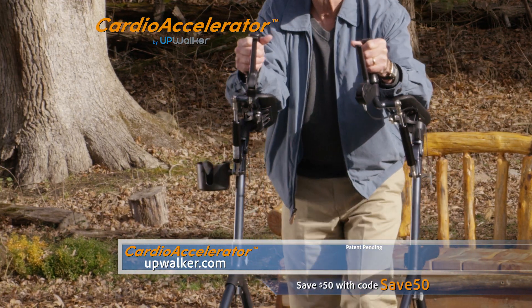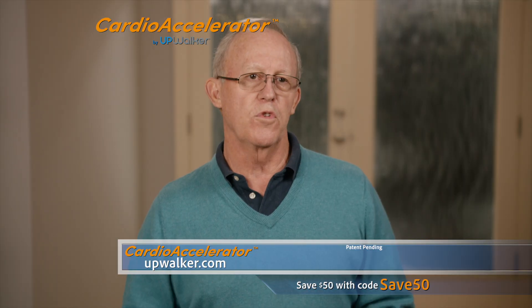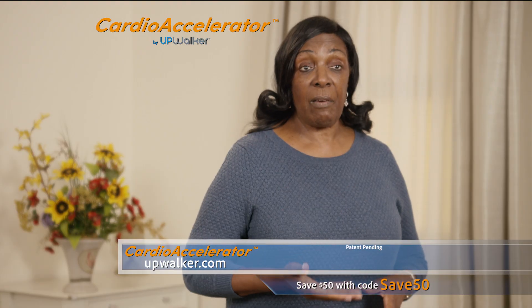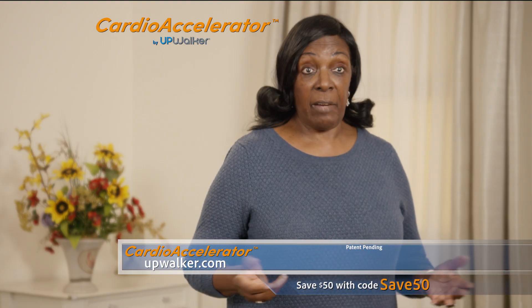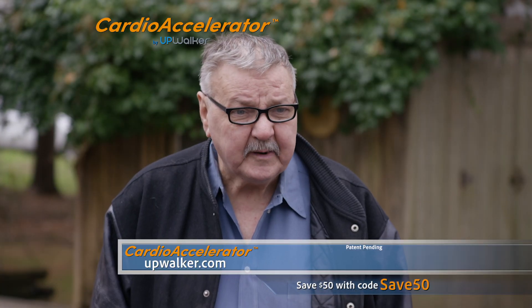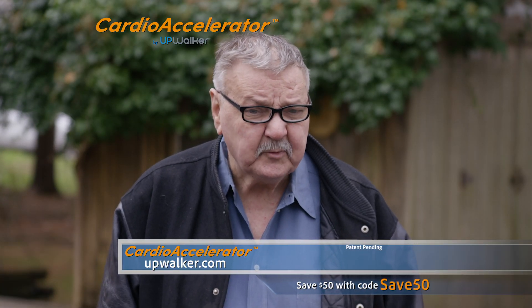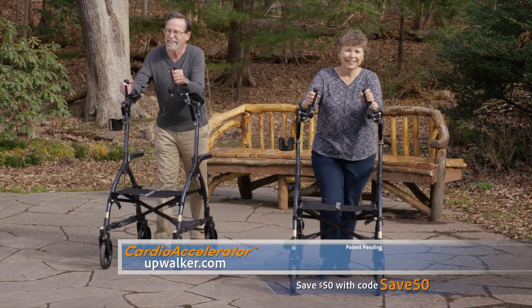The faster I move my arms, the more strenuous the workout. I can walk much further with the UpWalker and have more energy and less pain. I feel more confident. I walk upright and have more energy. The Cardio Accelerator made me feel much more comfortable walking. There's less pain in my back and I felt more secure on it.